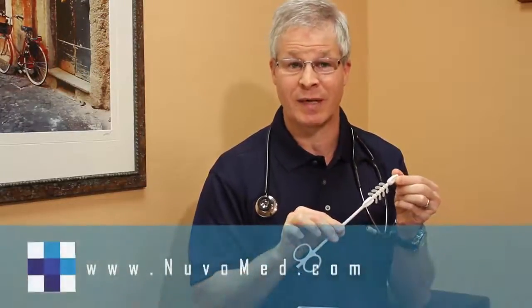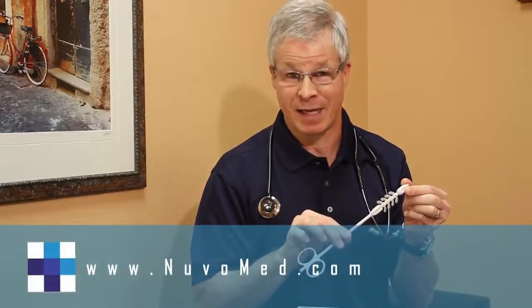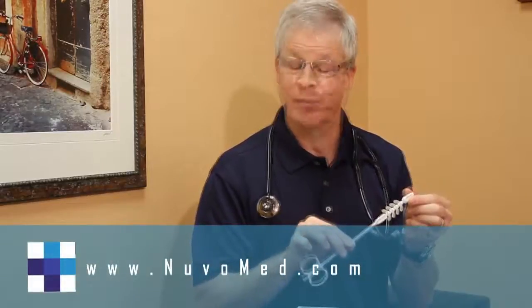What you'll see on the DisImpactor is that it is an injection molded polymer that has a long shaft that's quite flexible. If we start at the far end, you'll see that it has a bullet tip. The bullet tip is shaped to accomplish a few factors. The first is to allow easy entry past the anus into the fecal load. The bullet tip is also shaped to easily enter the fecal load itself.